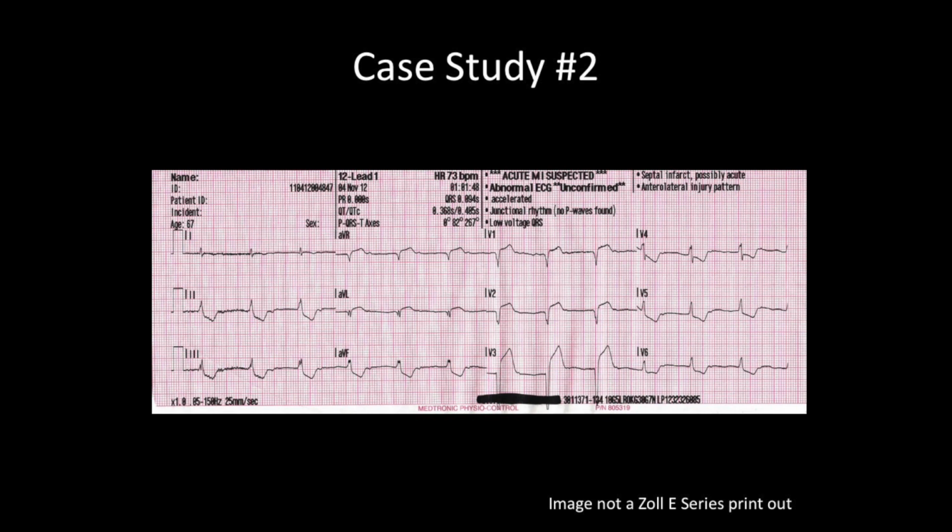So sometimes you have depressions. You don't always have to have elevation. That's where all of this gets very tricky, right, when you really get into it, but we don't really worry about that. I can tell you right here, this is very clear ST elevation MI, okay? And then this is elevation right here. So from here to the baseline is up. Here to the baseline is up, okay?